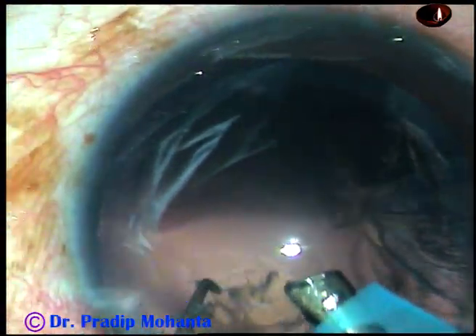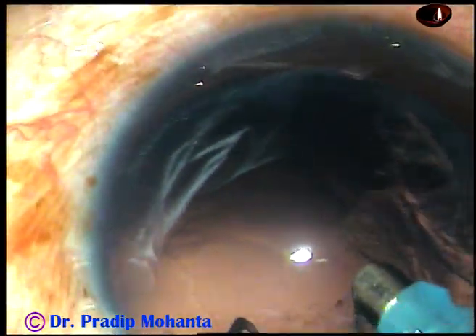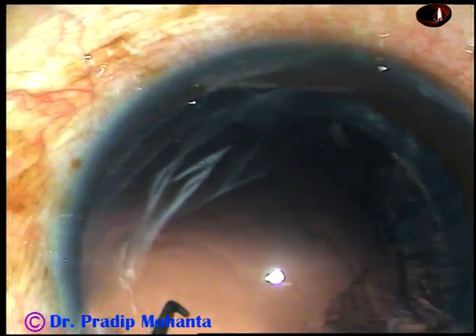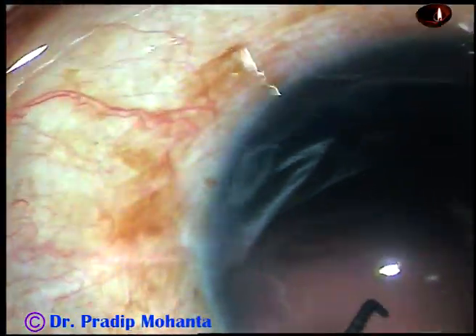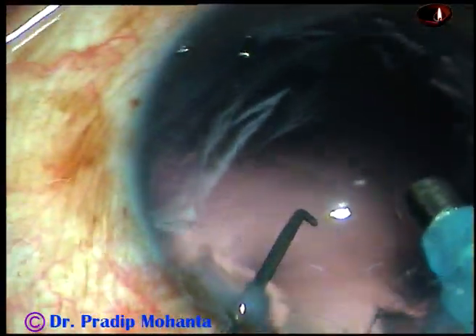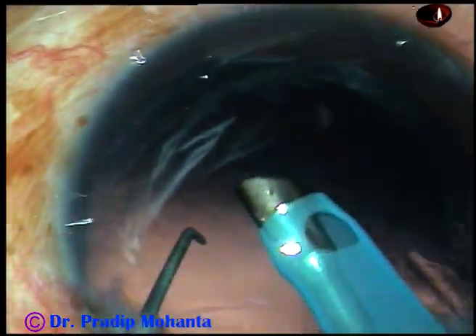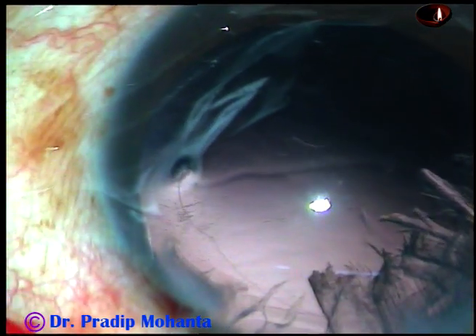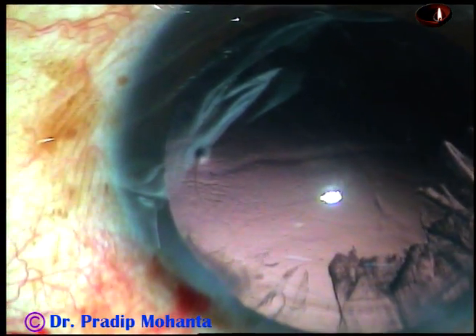We can reduce the vacuum now and try removing the cortex by the phaco needle itself. I try to do that, but do it only as long as your instinct says. Once you find that this is going to be dangerous — once you get a direction from your brain that this is going to be dangerous — stop, and use safer methods of cortical clean-up.